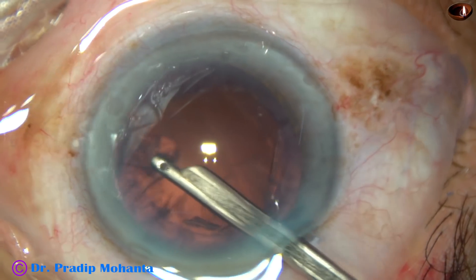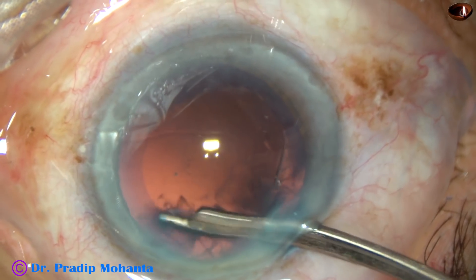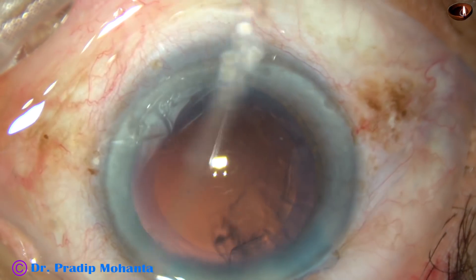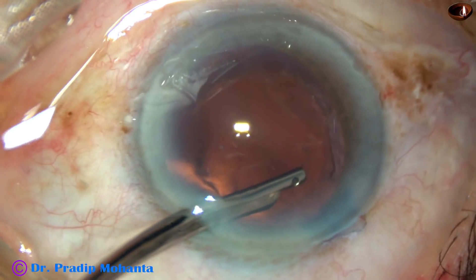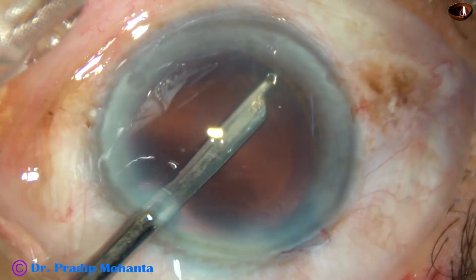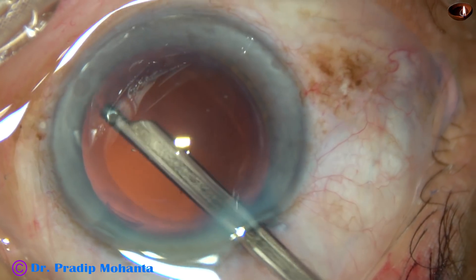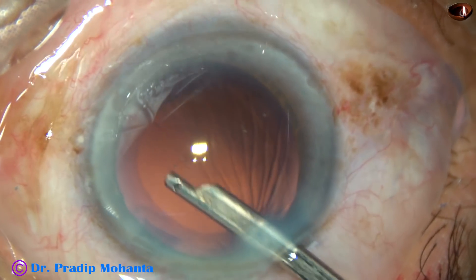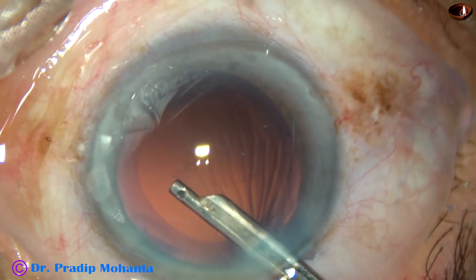After adequate vitrectomy, removal of cortical matter is very easy. We can do it with either a Simcoe cannula — this is a 23-gauge Simcoe cannula — or we can also use bimanual irrigation-aspiration for cortical cleanup. Here also, we can go at 7 o'clock. I was coming very slowly to check if I am pulling any vitreous strand or not. There is no vitreous strand, and cortical cleanup has been very satisfactory.